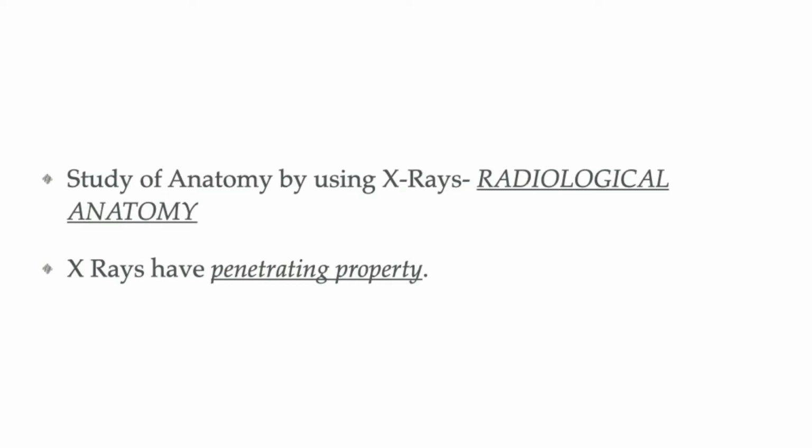However, a part of the X-ray may get obstructed on their way, which may either be because of the absorption of the rays by the human tissue or scattering of the rays. So, when these rays with the reduced intensity reach the photographic film, they impart opaque or translucent image on the photographic film, which we say as white image on the film.